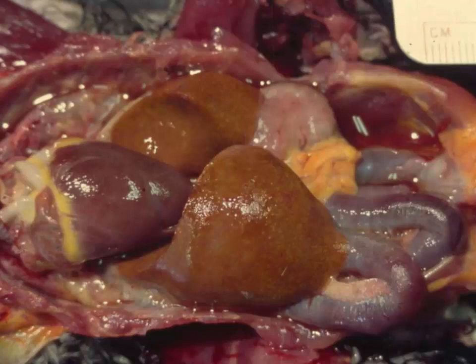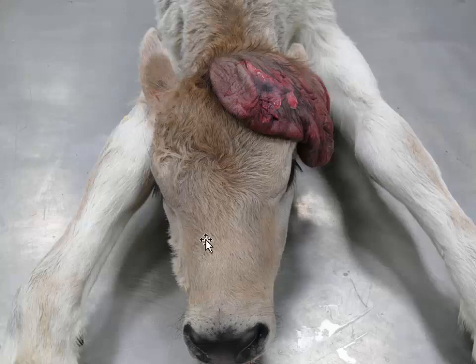Okay, slide number 3. This is tissue from a calf. How about giving me a morphologic diagnosis? Okay, time's up. Fairly straightforward one. I always thought this looked like a French calf who was wearing a beret. But what we're actually seeing is a meningocele. Now, if you said just meningocele, I'm going to take that too.